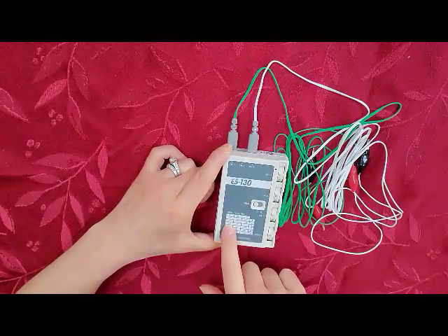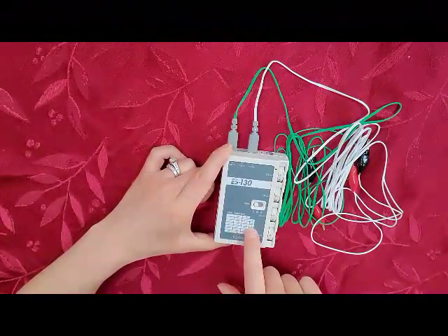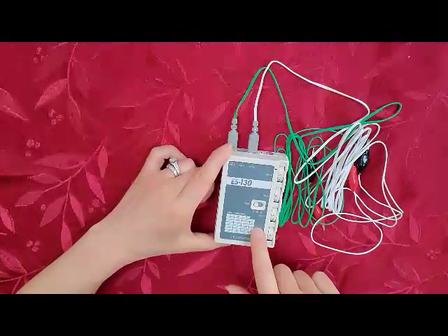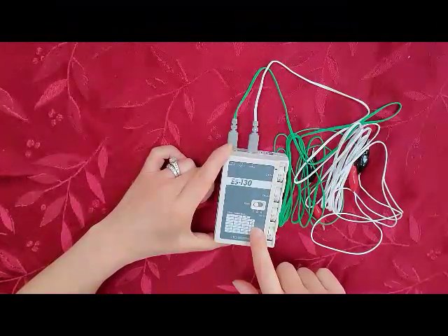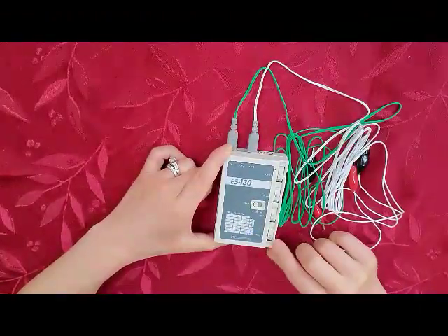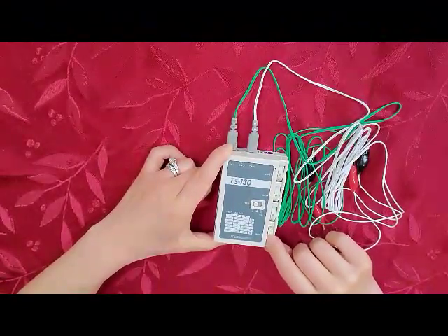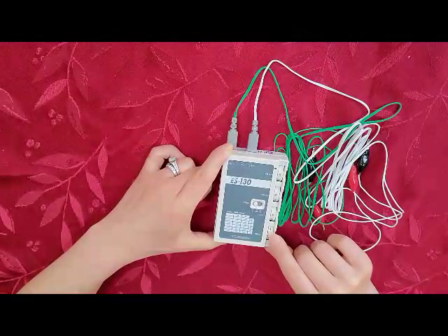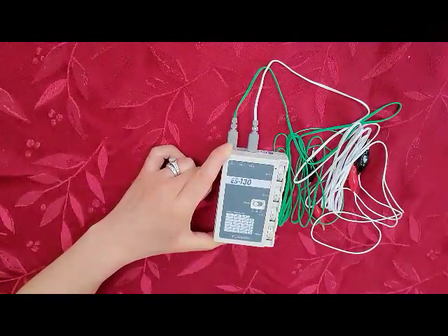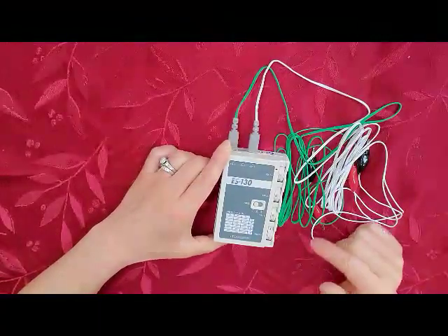Now, if we follow where that setting of 2 is between 1.5 and 2.5, if we follow that over to the right into this S column, we know that a frequency of 2 Hz is going to be somewhere between 4 and 6 on our frequency dial, so about 5. So now we come down to the bottom and we can turn this frequency dial to a setting of 5. So that is going to give us 2 Hz when we turn the unit on.